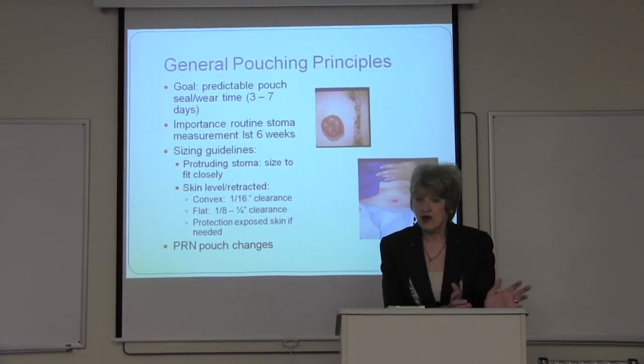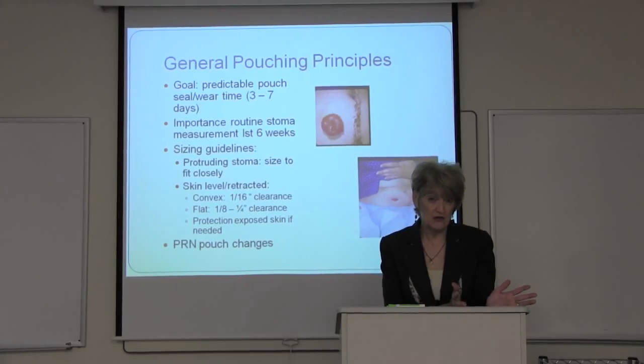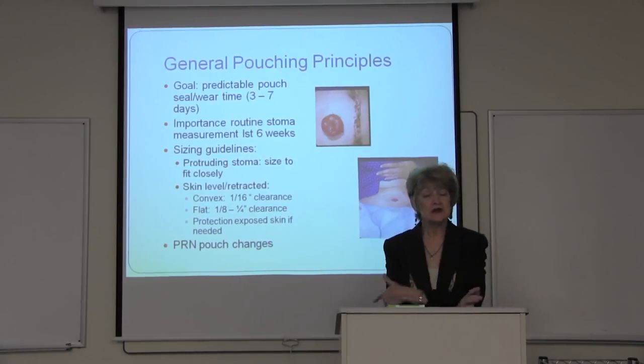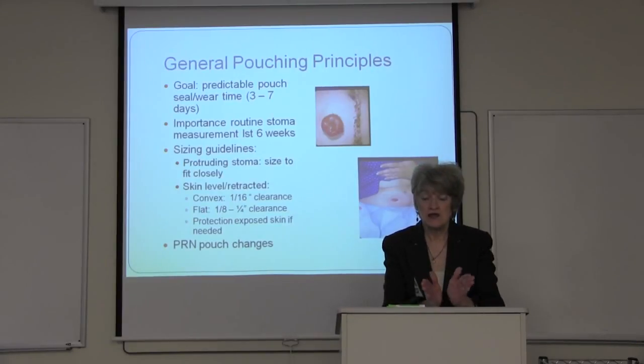If I never know when my pouch is going to come off, it's very hard for me to re-engage in activities of daily living because I'm worried all the time. So I want them, you want your patients to have a predictable pouch seal, predictable wear time. Typically we teach them when they go home from the hospital. In the hospital, we were changing your pouch every 2 days. So we know your pouch will stay on for 2 days.